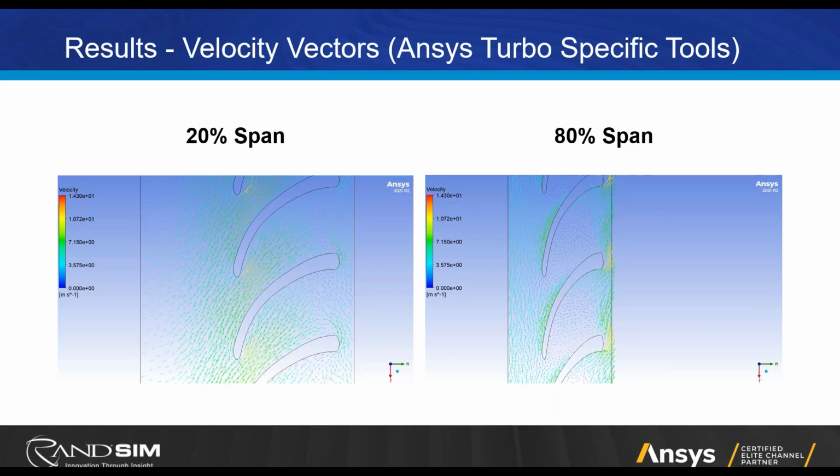So the image on the right is the same thing, but at 80% span. You can see the flow looks a little worse up there. There's a lot more recirculation. Very low velocity. That's not ideal. You want the flow to be uniform throughout the flow passage, and that definitely is not the case here. So there is a lot of room for improvement in this design. But this is really just to highlight the tools and how easy it is to see what's happening inside your rotating machine with these views.